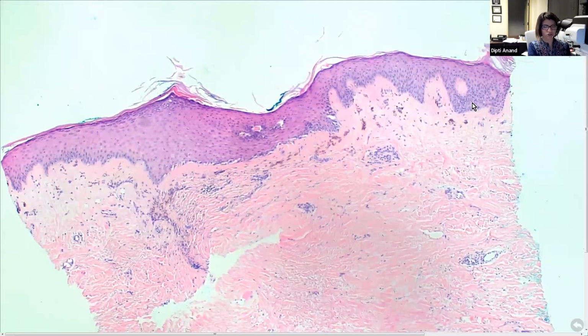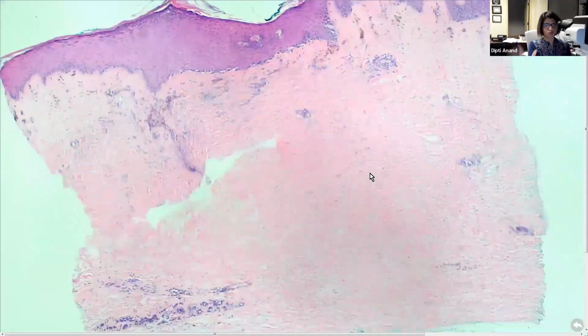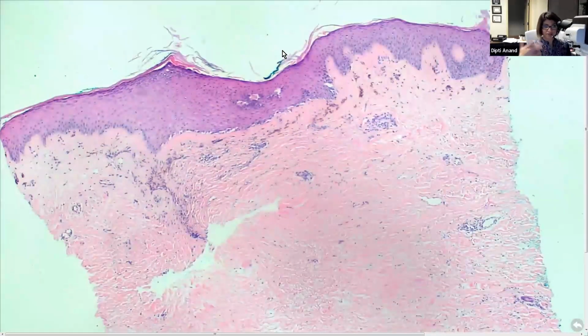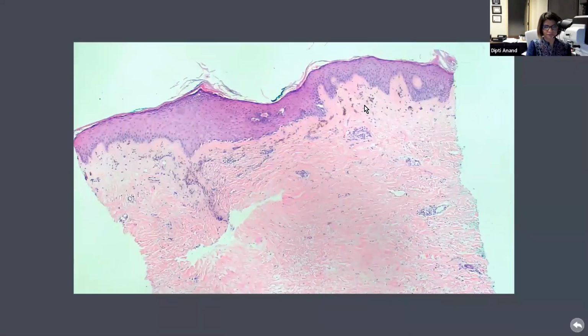But because I was telling you this, I want to tell you that chronic GVHD, which can be either lichenoid or sclerodermoid, which is indistinguishable from scleroderma, the overlying epidermis can show some interface change. So this was actually from a patient with chronic sclerodermoid GVHD. You wouldn't be asked to distinguish this on your boards. On your boards, this will be morphea/scleroderma. You can see the nice entrapment of the sweat gland. But because we were talking about it, I wanted to pinpoint that. The next time when I teach you these slides, I won't even distract you by telling you that. But because you were smart enough to recognize that, I wanted to show you.